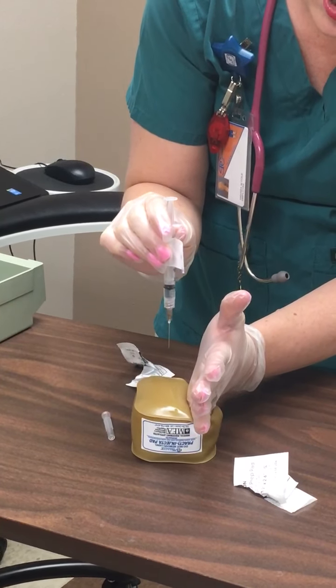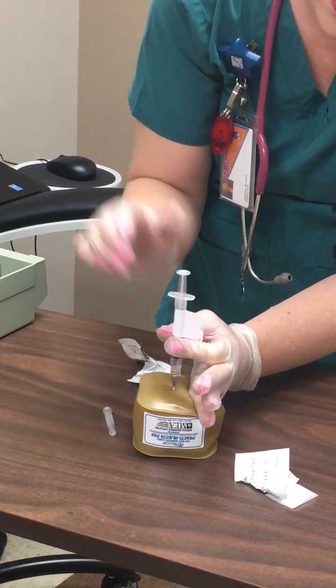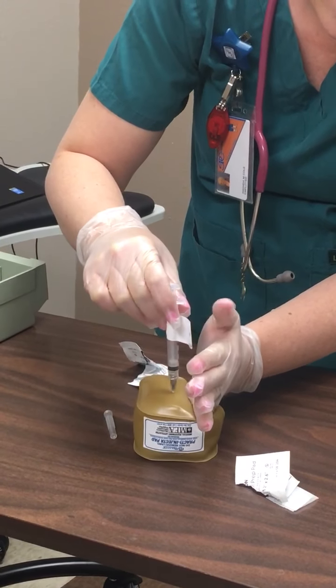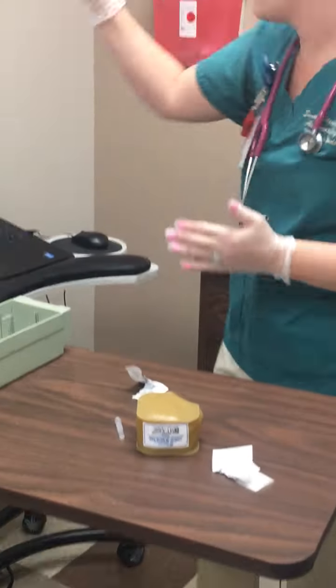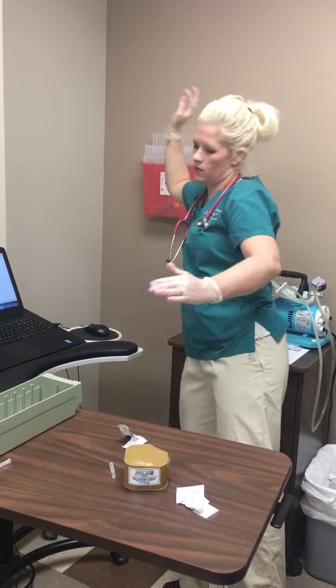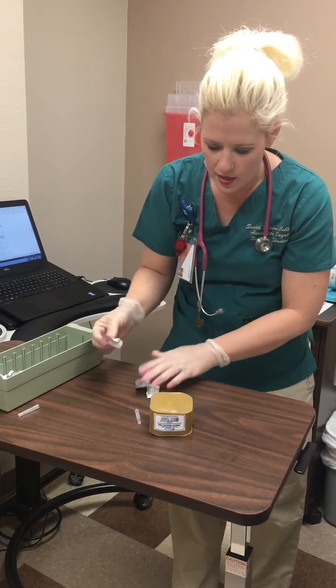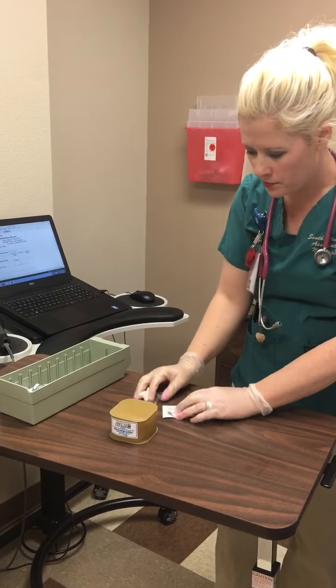So I'm going to go ahead in a darting motion stick. 1, 2, 3, and stick. I'm going to stabilize, and I'm going to push in slowly and count to 10. 1, 2, 3, 4, 5, 6, 7, 8, 9, 10, and out and straight to the sharps. You can go ahead and clean that site. Was that okay, Mrs. Smith? Yes. Well, hopefully you won't get the flu this year, okay?